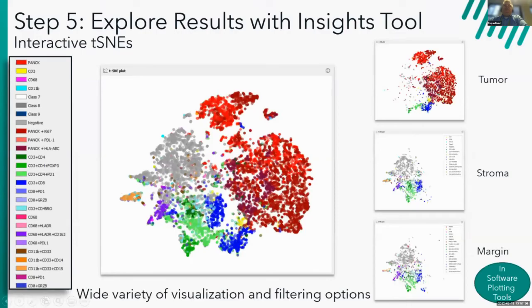I can actually take this a step further and start filtering information from the 2-dimensional reduction plots by looking at the individual compartments, and do I start to see differences between these different compartments? If I have different cohorts of treated and untreated samples, I can separate between those. I can look between different images, and I can really start to explore this data in ways that if I just look at images, it's hard to understand because you have to remember from image to image what you were looking at. These plots and the way that you can interact with these plots to go back and look at the individual objects in the image gives you a very dynamic and interactive way to troubleshoot and explore your data deeper and further.